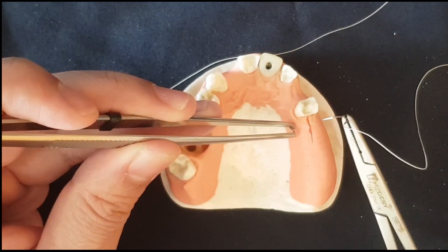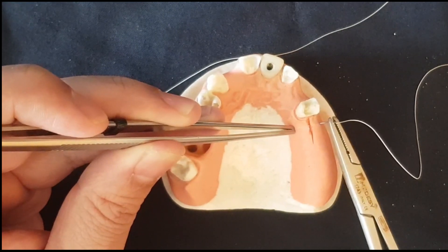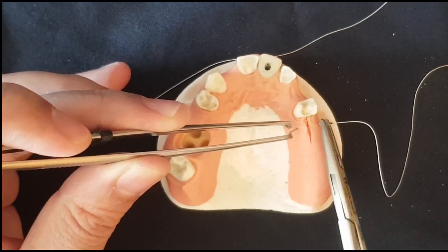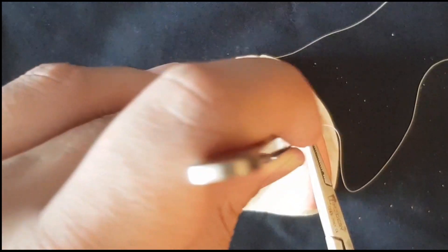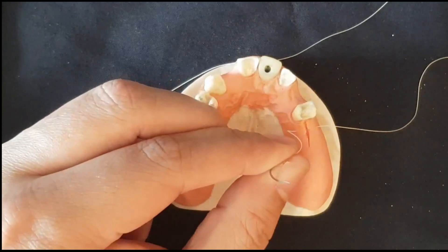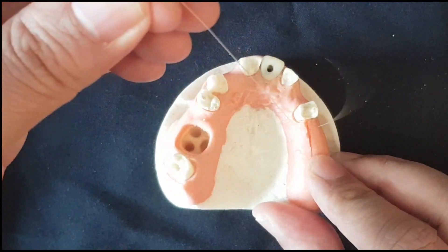Take a deep bite and an equal bite on the opposite side, which is the palatal side in this case. The distance from the incision to the point of entry on the buccal side should be the same as the point of exit on the palatal side from the incision. So let's take a bite and try to come out at an equal distance from the other side, using the Adson forcep to push. The second thing is to follow the curve of the needle — if you try to pull it out straight it will tear the tissue, so push from the other side and gradually follow the arc of the needle. When it is out, hold it again at a point three-quarters from the back end of the needle.